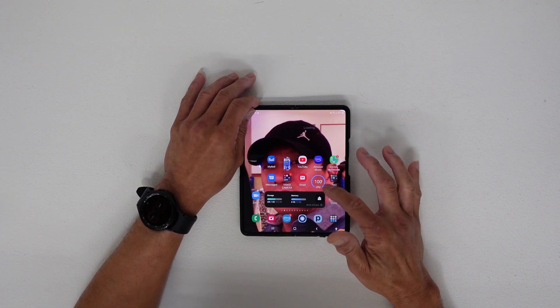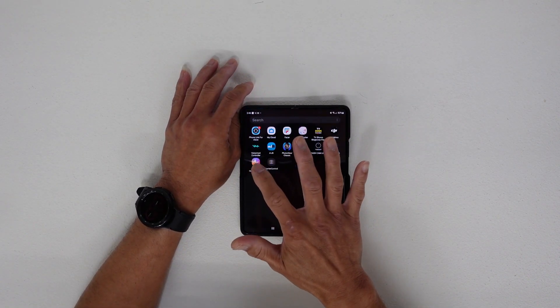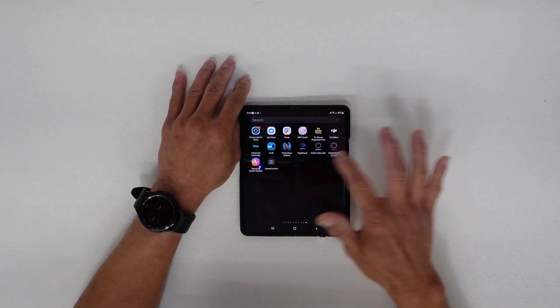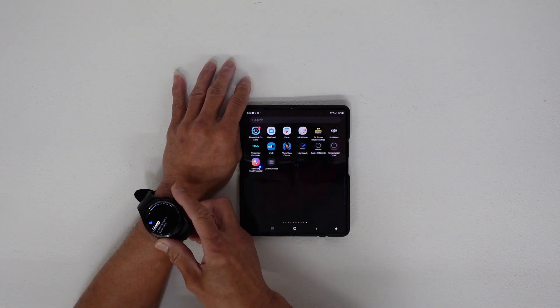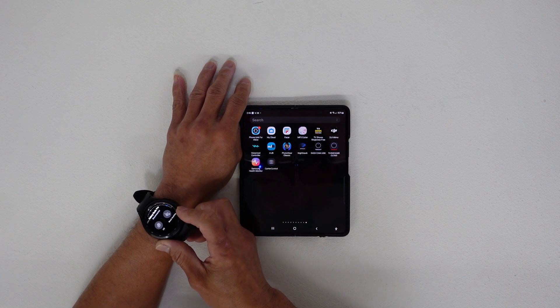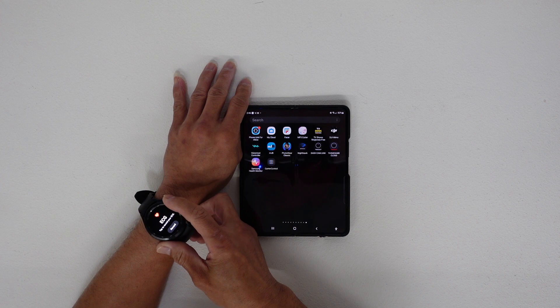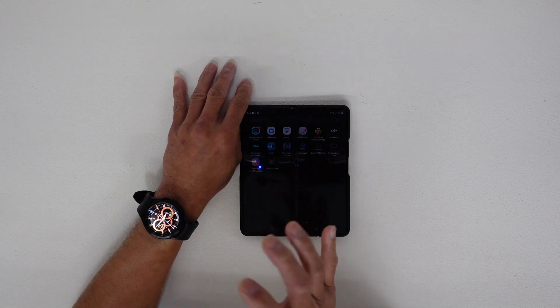First, you have to download the Samsung Health Monitor on your phone. After downloading Samsung Health Monitor, you can use the blood pressure monitor. I already have the blood pressure monitor and ECG set up here.